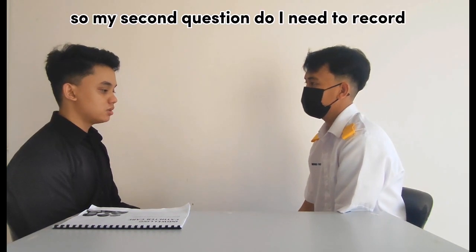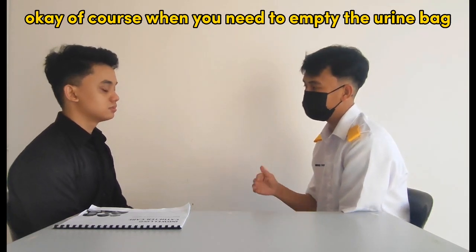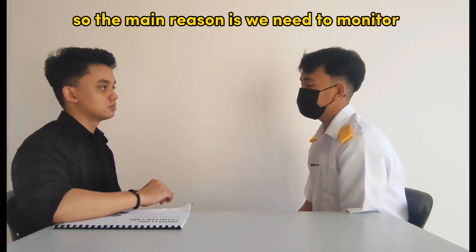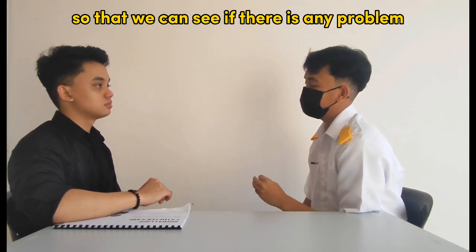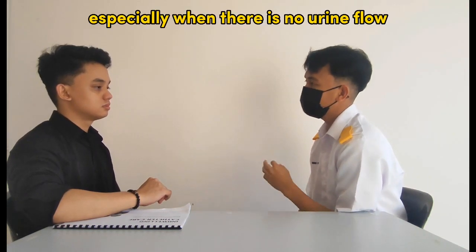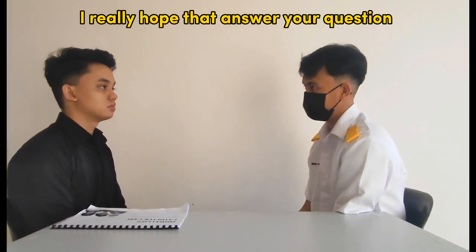So my second question, do I need to record the volume of the urine bag or not? Okay, of course, when you need to empty the urine bag, you also need to record the volume. The main reason is we need to monitor your father's input and output so that we can see if there is any problem with the urinary catheter, especially when there is no urine flow. I really hope that answers your question.